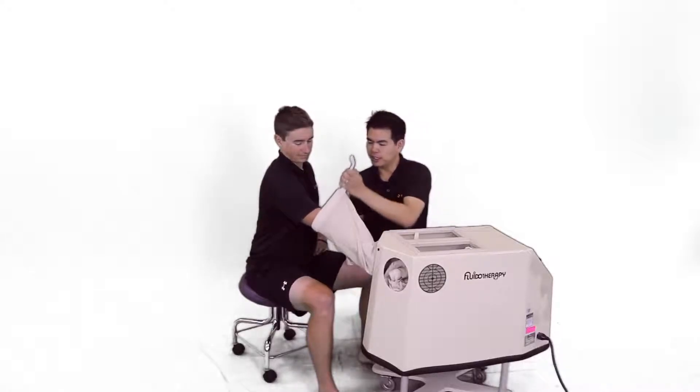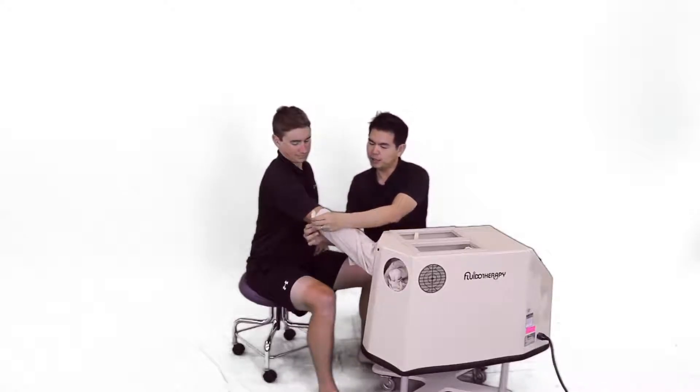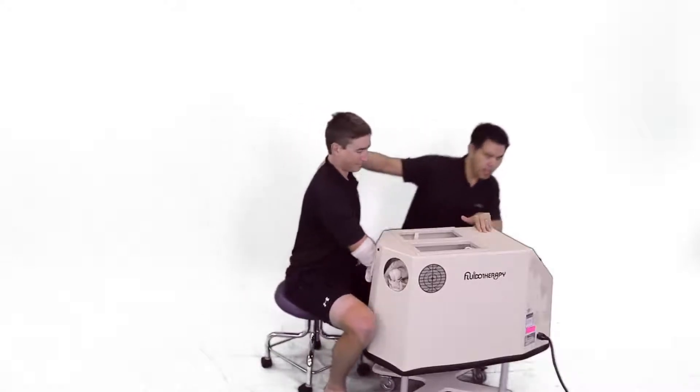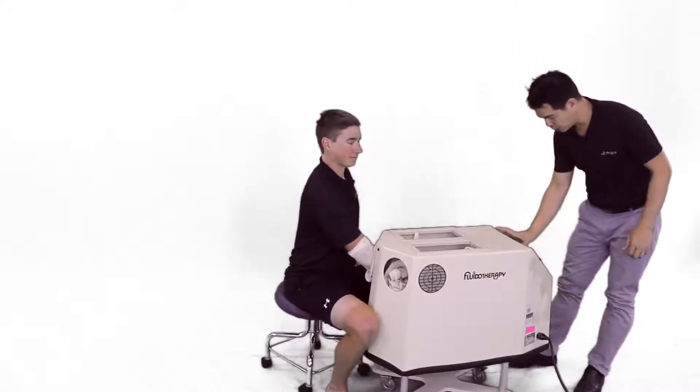So we're going to seal this off so that the corn husks don't come flying out. Okay, you can come in a little bit deeper. And now I'm going to start the treatment.